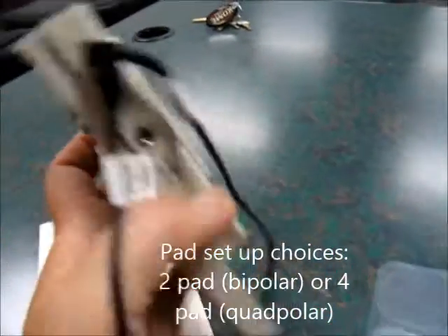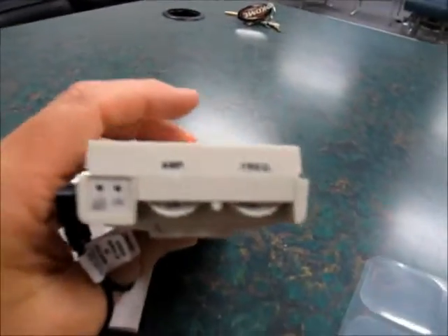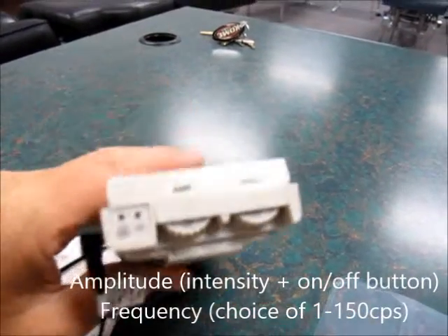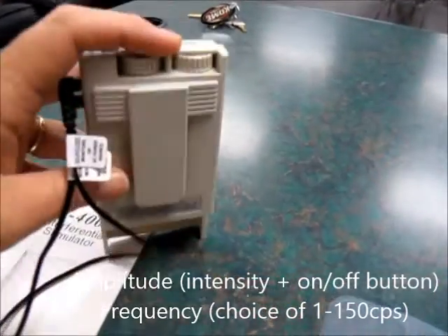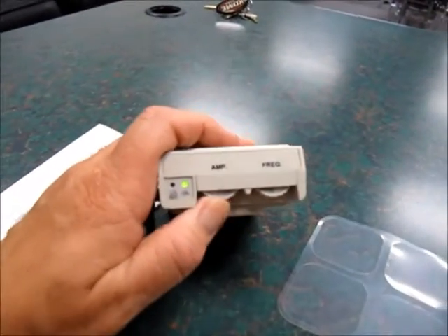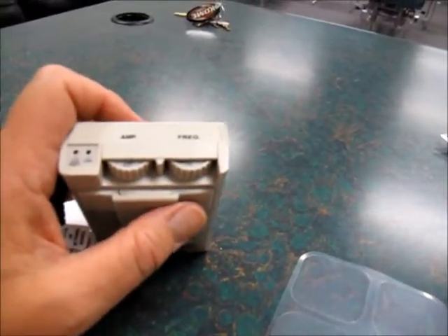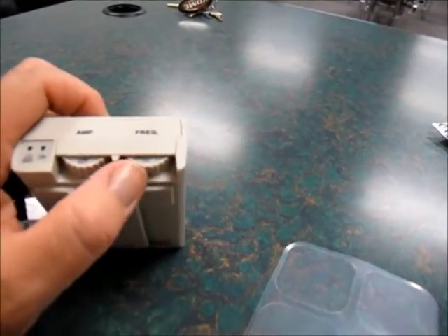On the top here, if we turn it upside down, you can see that there's a place where you can turn on the amplitude. When you do that, the green light will show up — you can see the green light right there. And then over here is where you're going to change the frequency. Right now it's set to 150.